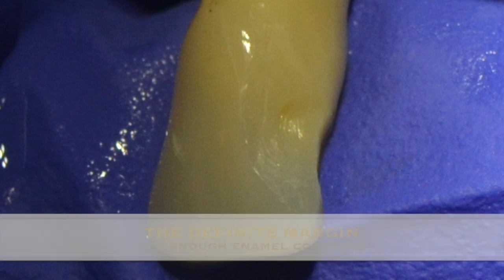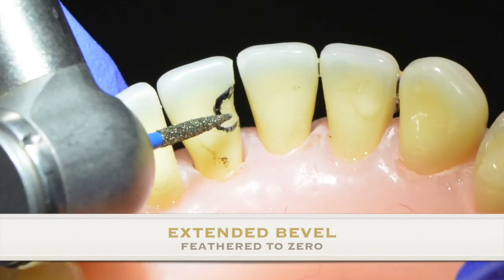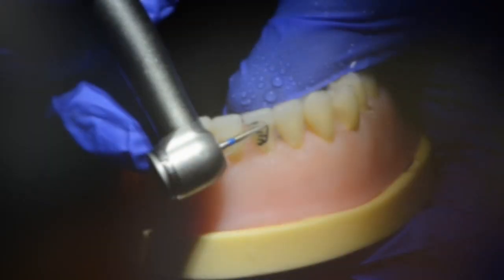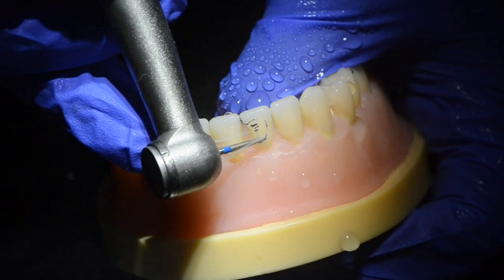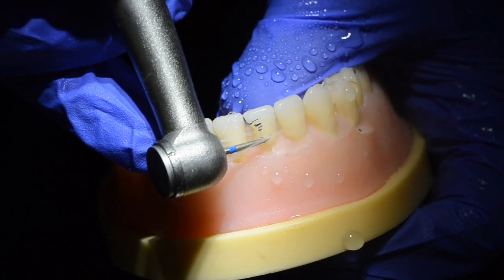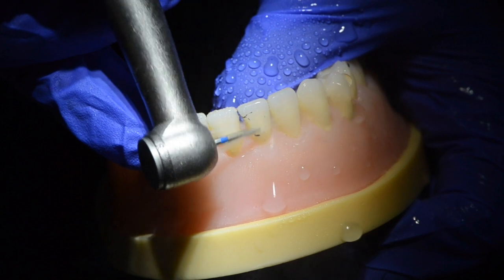What I am proposing is borrowed from my learning at BioClear Tacoma under the guidance of Dr. David Clark. With the use of a long tapered diamond, I am proposing that we extend the margins of the bevel to include more of the palatal and labial surface, harnessing all that lovely enamel there to strengthen your restoration.